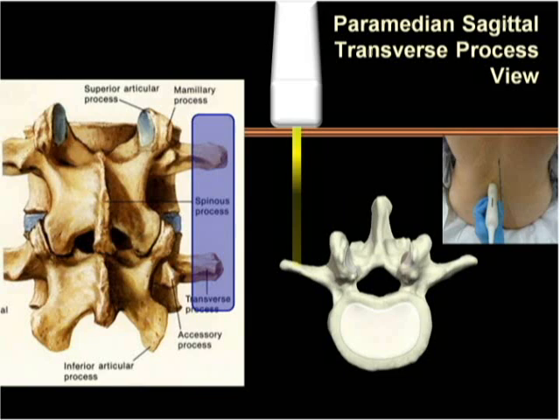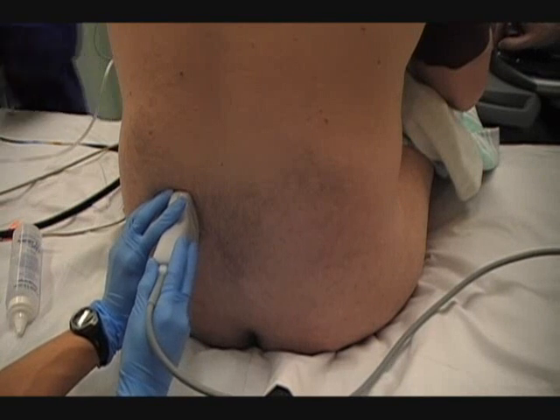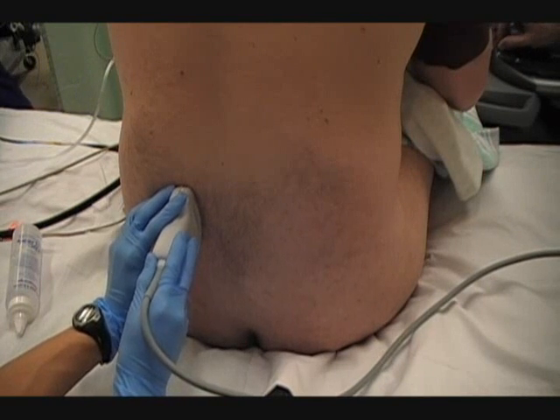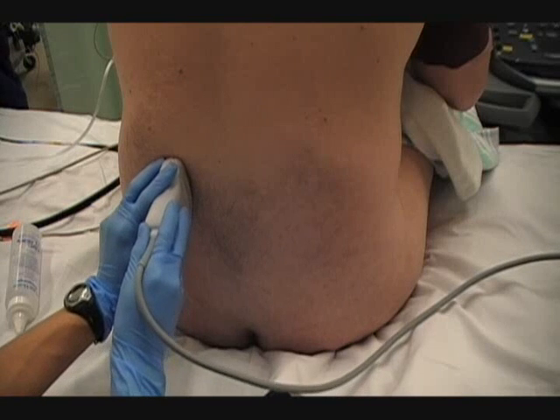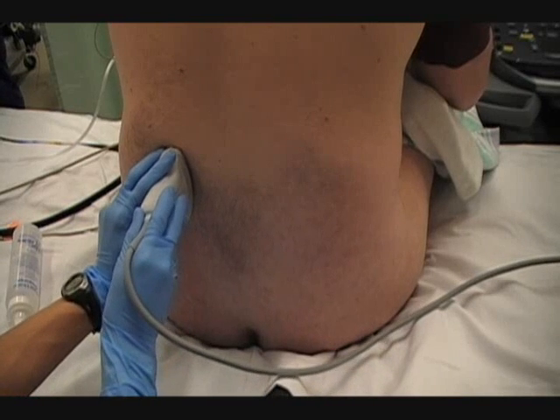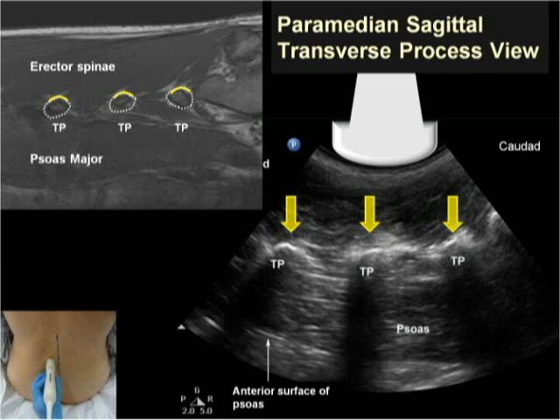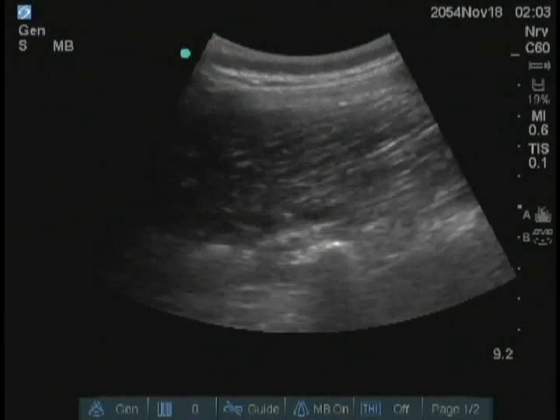It is possible to go straight to acquiring the sagittal oblique view, but less experienced operators may find it easier to start by placing the probe just above the sacrum and lateral to the midline to acquire an image of the transverse processes. The transverse processes cast acoustic shadows over the psoas major muscle that resembles the fingers of a hand or the prongs of a trident.